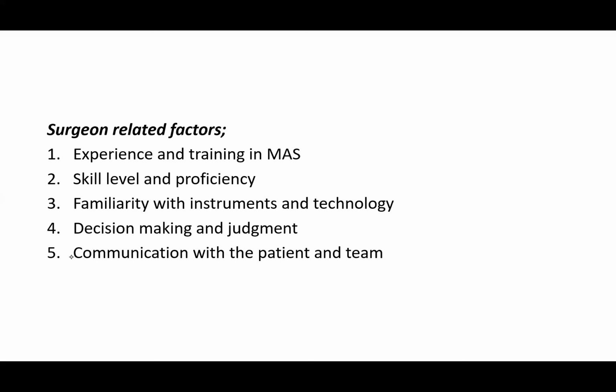It is very important that all the members of the team understand and are able to identify all the instruments and understand their functions, because during the procedure, especially the peri-op nurses should be able to identify what a surgeon needs and when he needs it. Okay, so it's very important we all become very familiar with all the instruments.